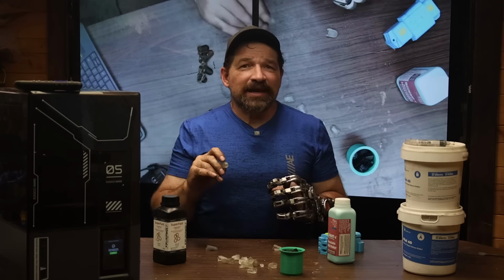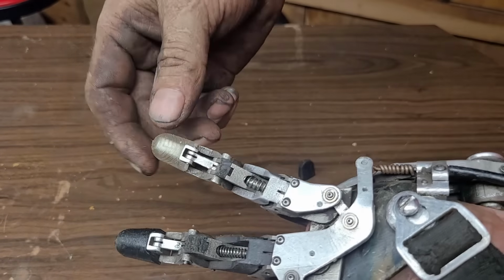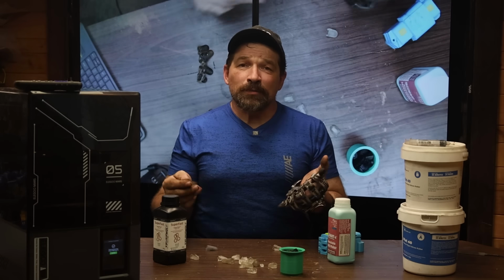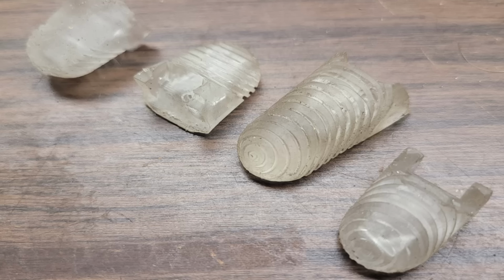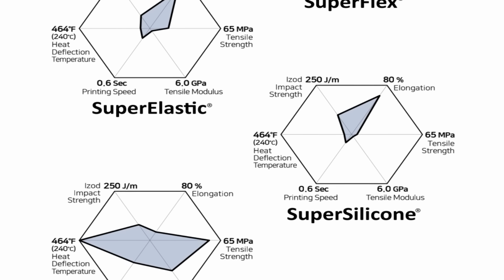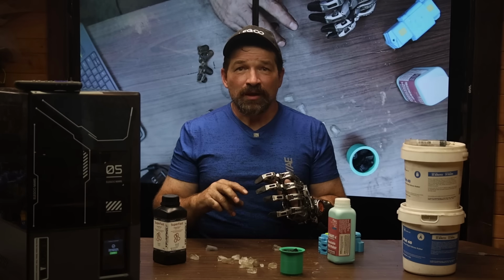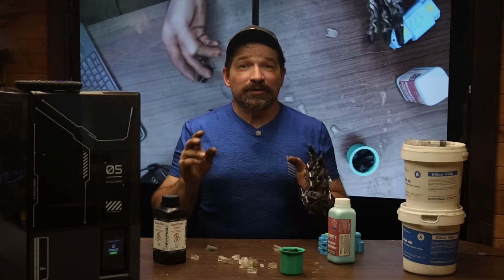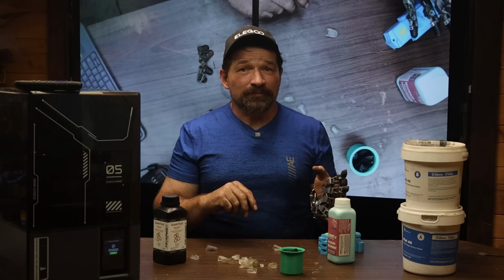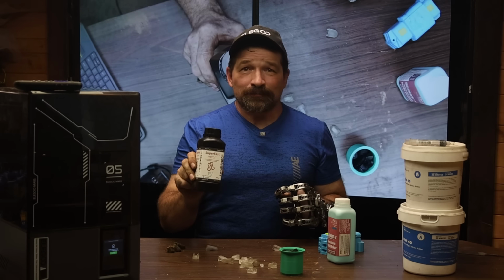I'm pretty sure that I have the scaling just about right for the tang, because it's not too tight, not so loose that they fall off, but it seems to be a consistent thing that after a couple days, small tears start to form on the tactile side of the fingertip. Now, I don't know if this is a modulus of expansion contraction type of thing, or if this is something that is actually happening from the actual use. But it's not something I was seeing when I was overmolding a printed core with silicone or polyurethane. This is a feature that I've only seen using the flexible resin.